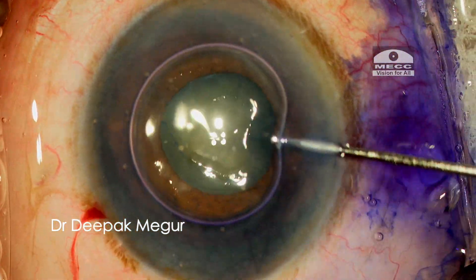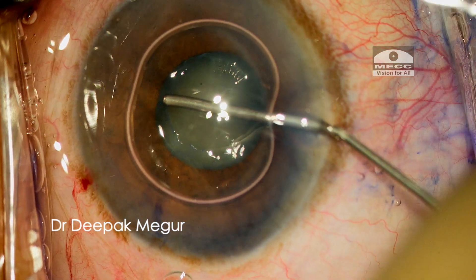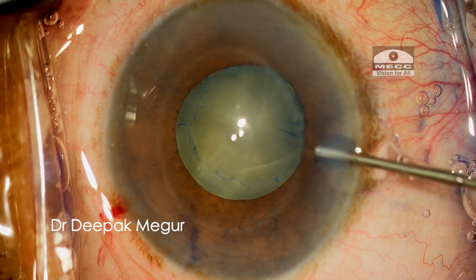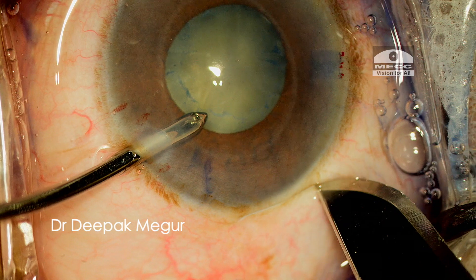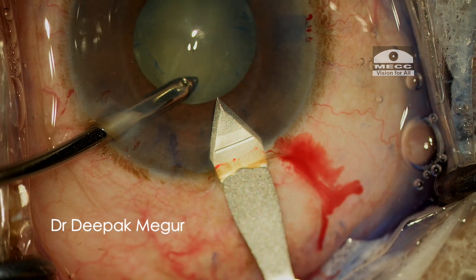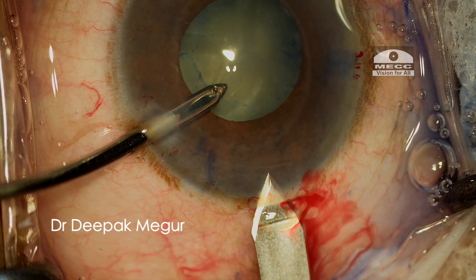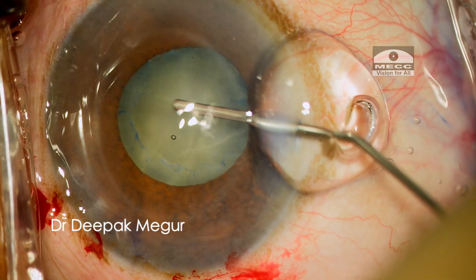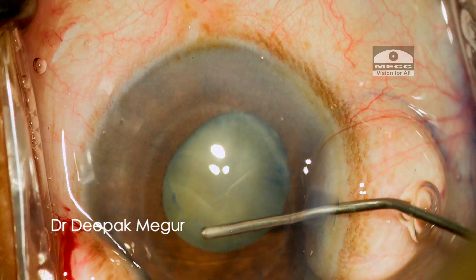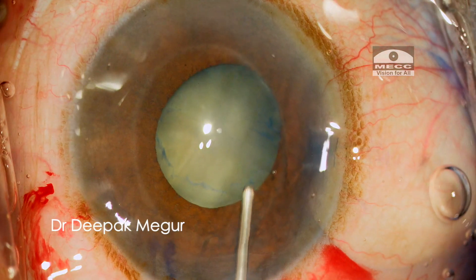I plan to use the B-hex ring as my pupillary expansion device in this eye. After staining the anterior capsule, I am using dispersive OVD in the anterior chamber. I am creating a 2.2mm main incision. I am also using cohesive OVD under the iris just to tent it up a bit so that it's easier to hook during the stretching manoeuvres and also while engaging the pupillary expansion device.